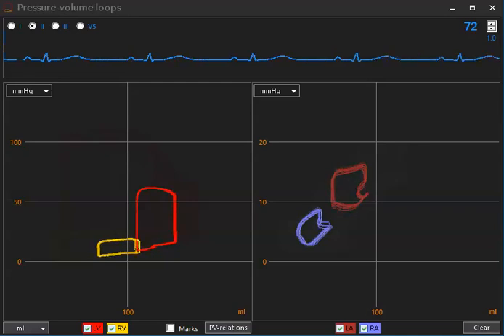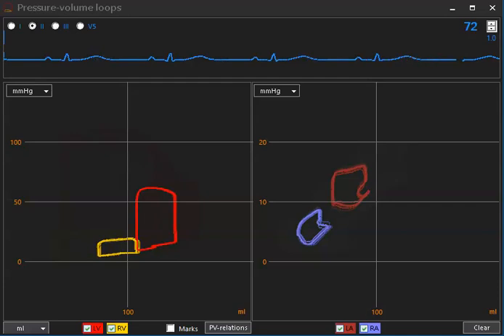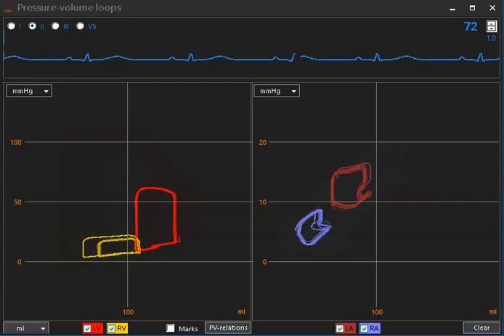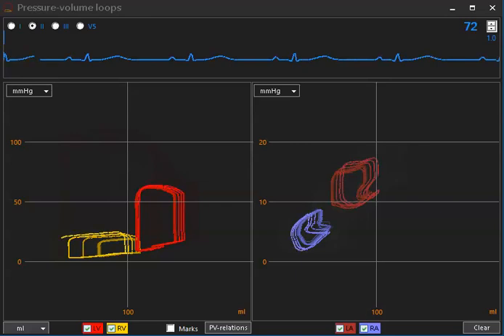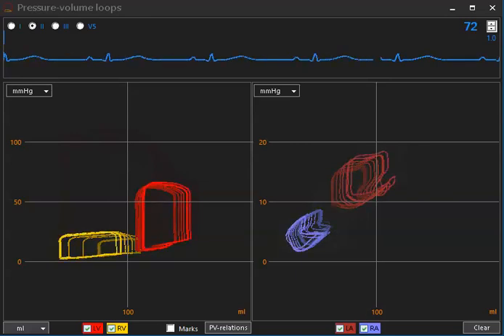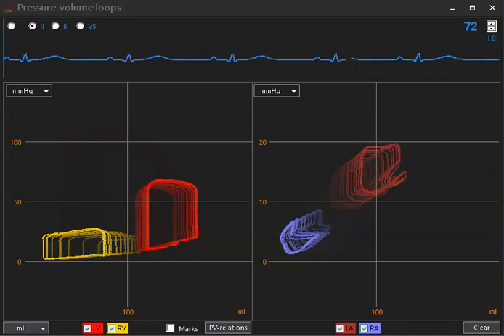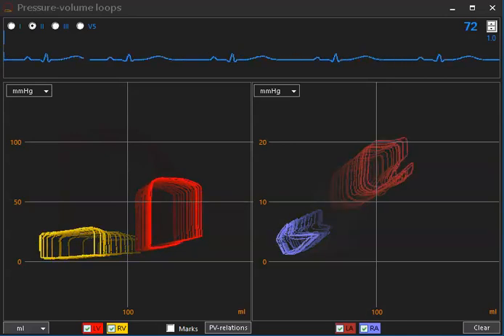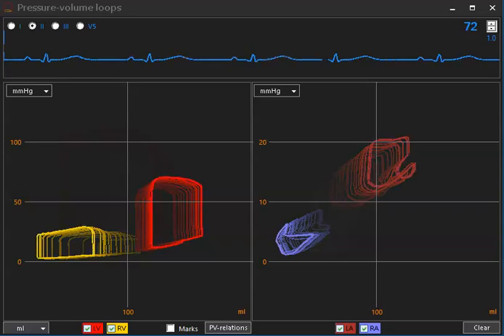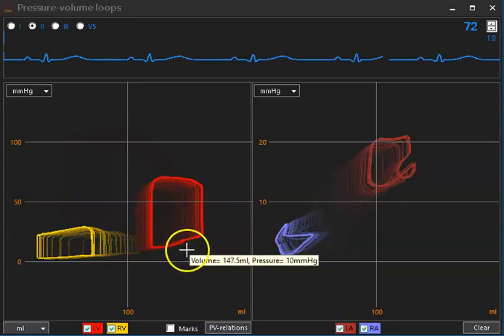So I start to increase right heart function. Now you see that output of the right heart increases, and in parallel with that, we see a slight dilatation of the left ventricle.